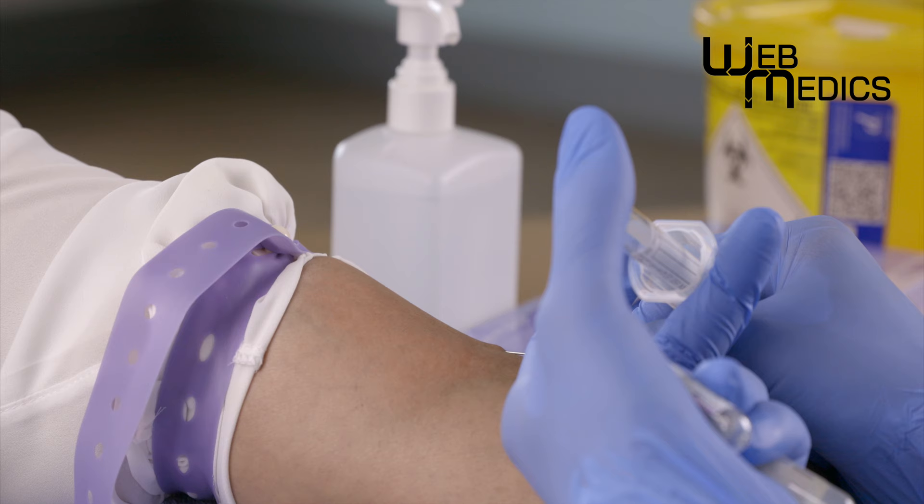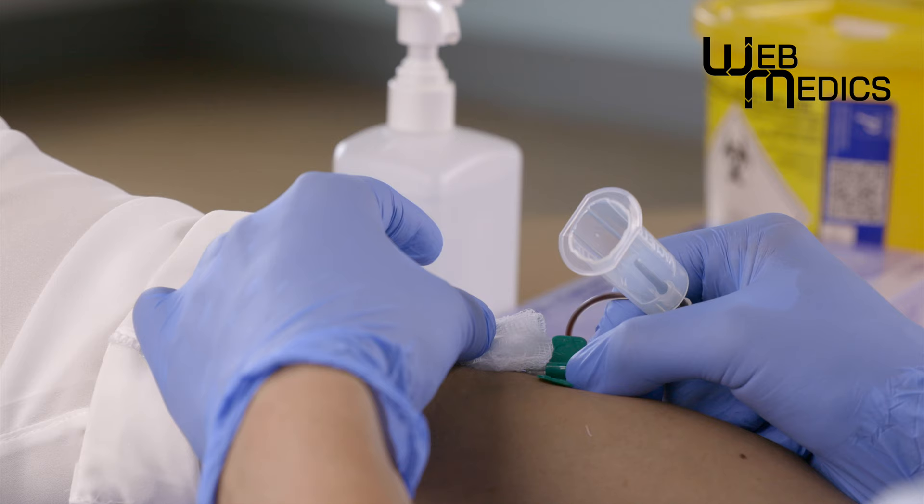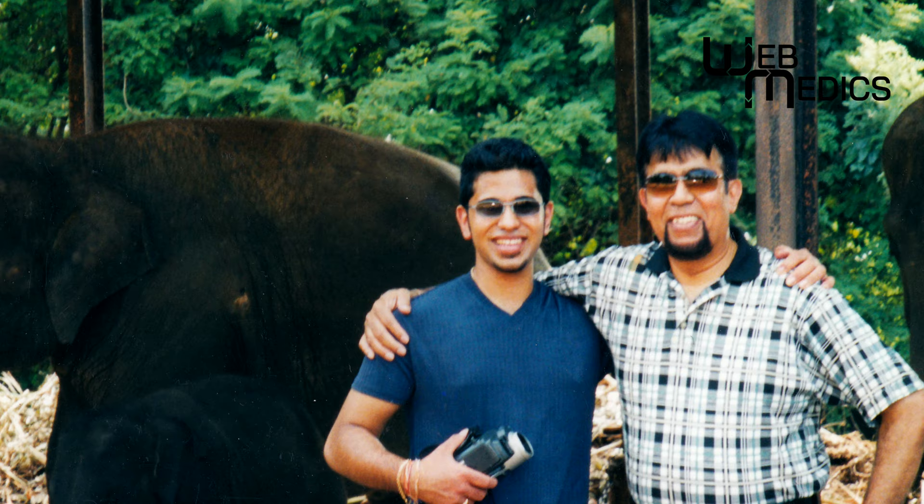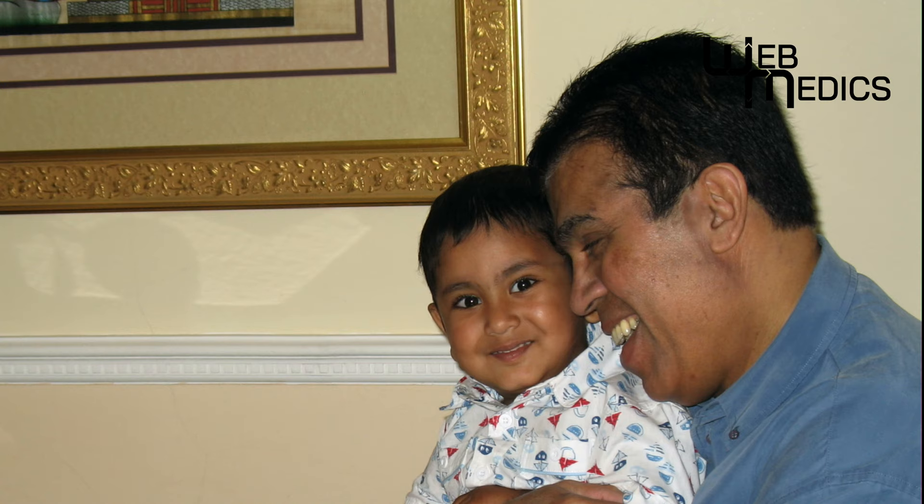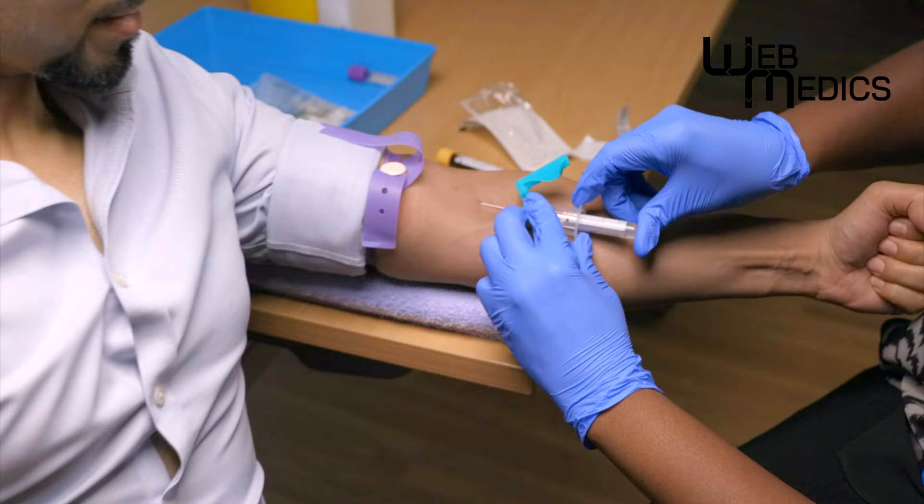Can good technique like position, angle, and maneuver help us get there? My father was misdiagnosed partly because of a series of unsuccessful blood test attempts. This taught me the importance of getting it right, first time, every time.